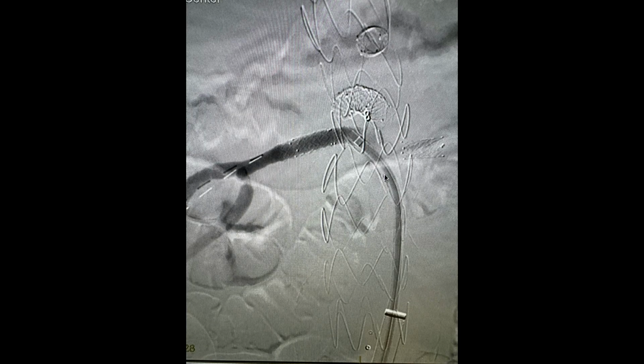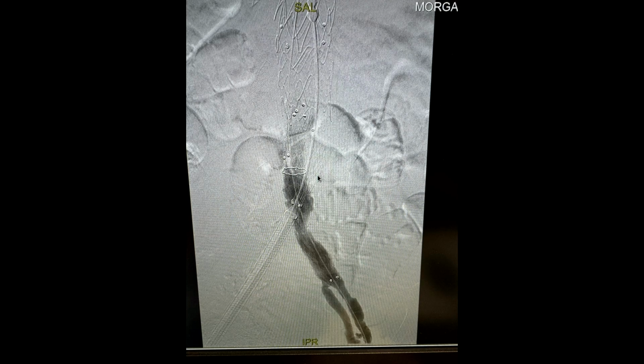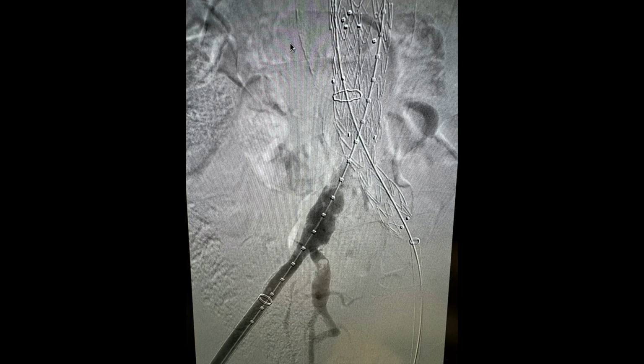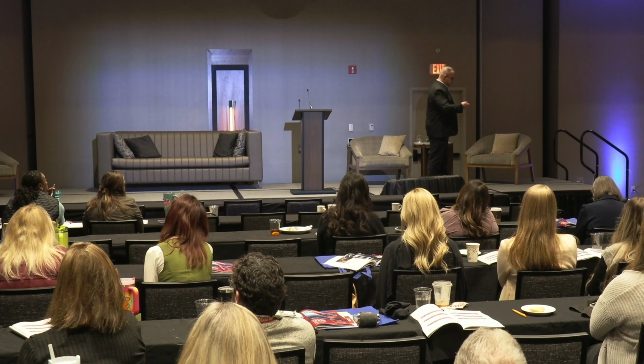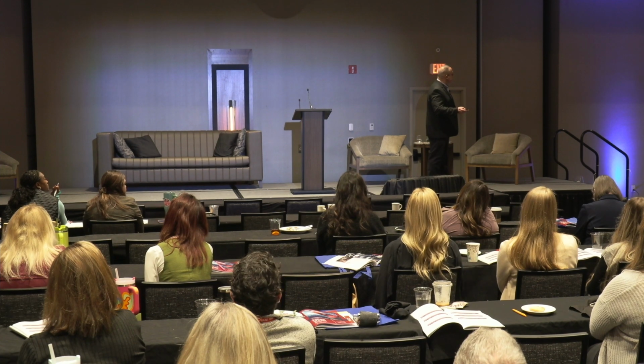You essentially line up the laser with the stent, burn a hole, balloon it, place another stent back into your endograft. Here, and then we next attack the right renal, the left renal, and then we finally finished up with the celiac artery. We then take another endograft, which is bifurcated, and bring it down all the way into our seal zone in the left common iliac artery, and then into the right common iliac artery, and then you have a finished product.